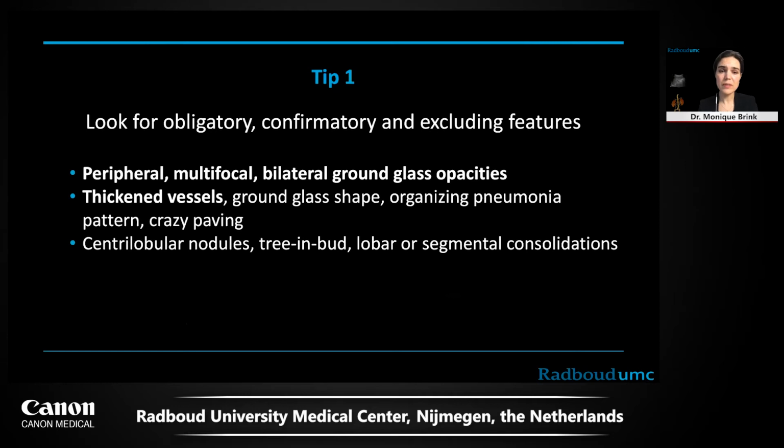So my first tip is look for these features. The peripheral multifocal bilateral ground glass opacities, which are obligatory, and also the confirmatory patterns. And if they're not present, look for excluding features, which are more typical for other pneumonias.